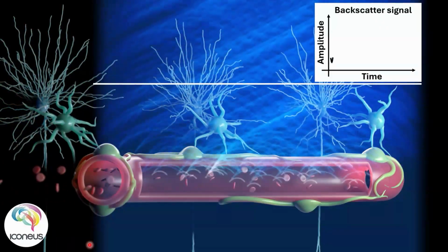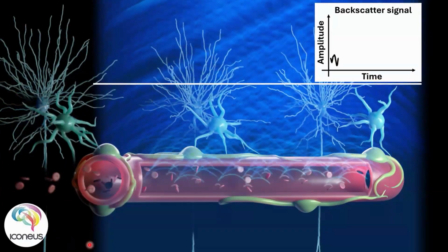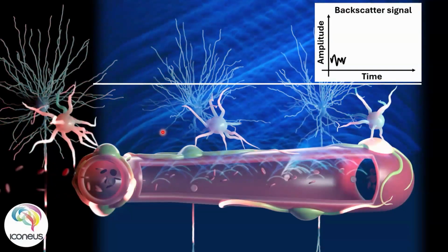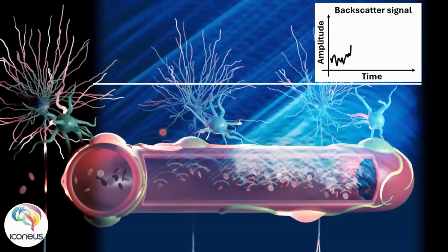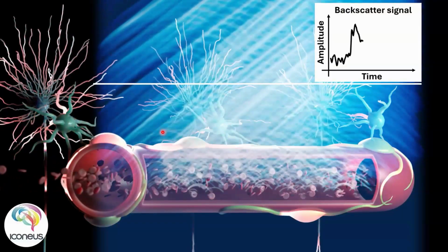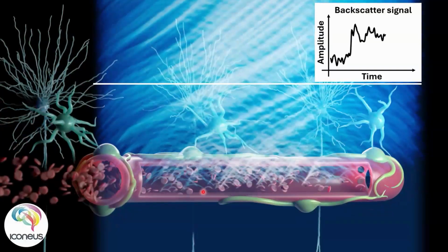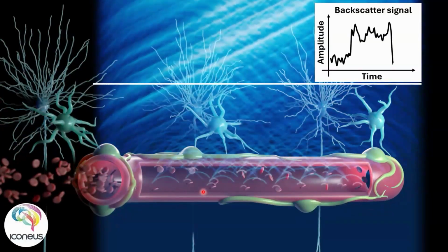And I'm saying this because the power Doppler signal that we measure when we send an ultrasound wave into the brain, as you can see from this blue wave here, what we measure with functional ultrasound is directly proportional to the cerebral blood volume, or CBV, which is the amount of red blood cells moving through the pixel at each specific time, as you can see here. So more red blood cells, more volume, more signal, as you can see from this depiction.